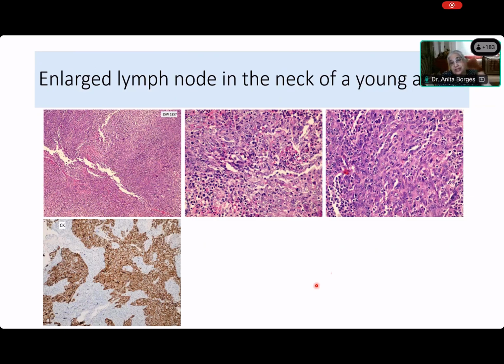It's a metastatic carcinoma in a lymph node, in a young adult's neck. So what are those carcinomas that metastasize to lymph nodes? Come on, Aishwarya, or Deepak. Any carcinomas that metastasize to the lymph nodes in the neck? Come on, all of you except for Navneet are third year. Ma'am, squamous cell carcinoma, P40 and P63. Yes, excellent. So could this be a squamous cell carcinoma?